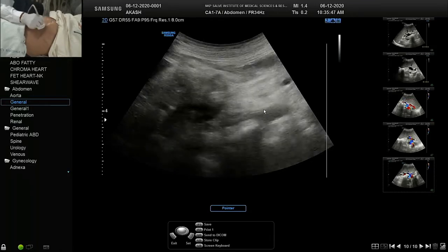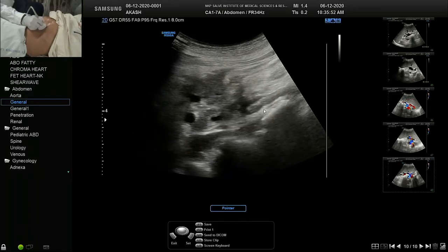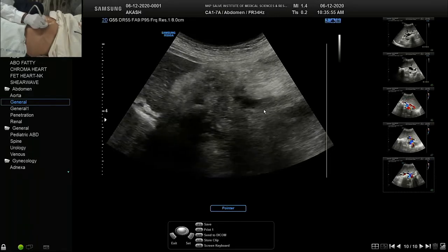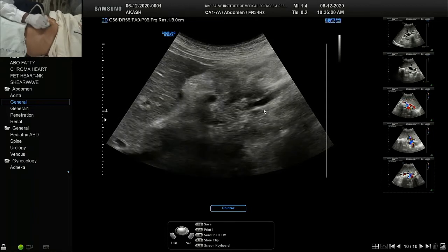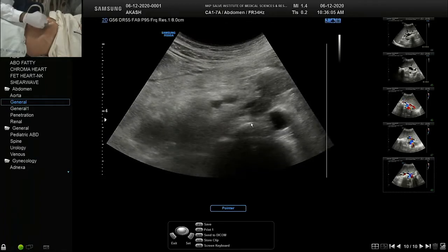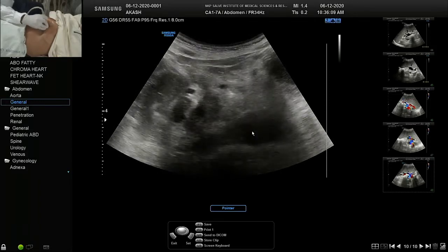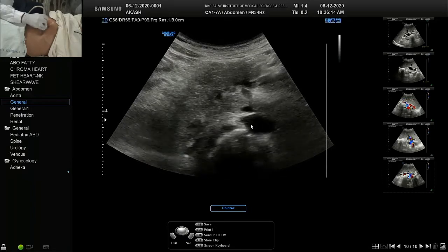We'll check for the SMV. Again there is jumble of vessels and heterogeneity due to pancreatitis. So we see our other rule. We check for the SMA and SMV relation. That is aorta, the celiac trunk.